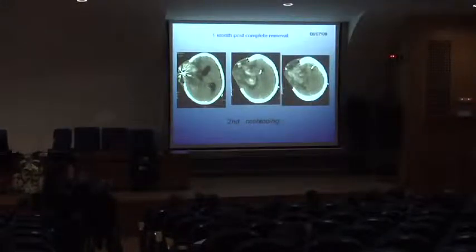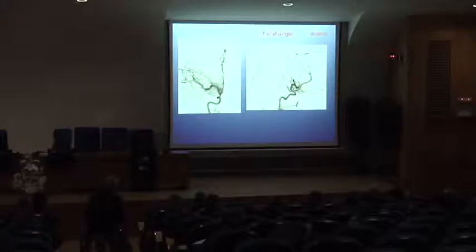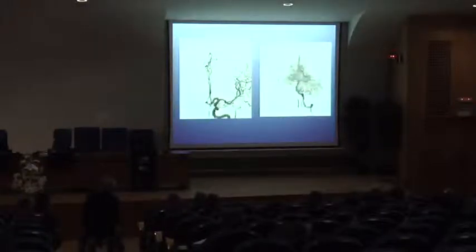And 1 month later, total removal of the AVM, a second rebleeding. Okay, this is the final angio. 2 months later, total cure of the malformation, the autoregulation is normal.